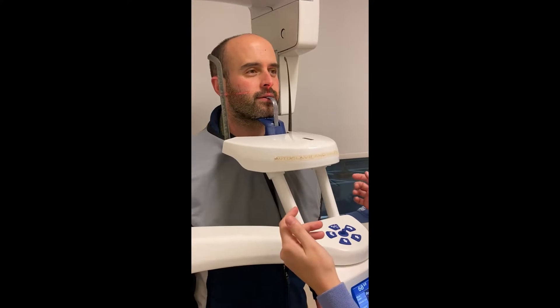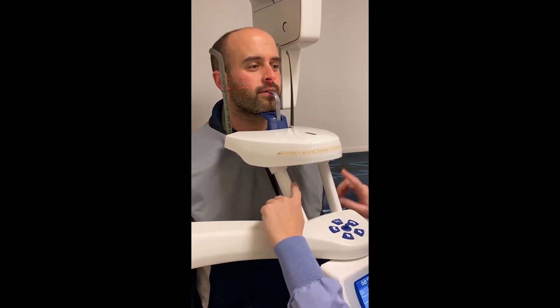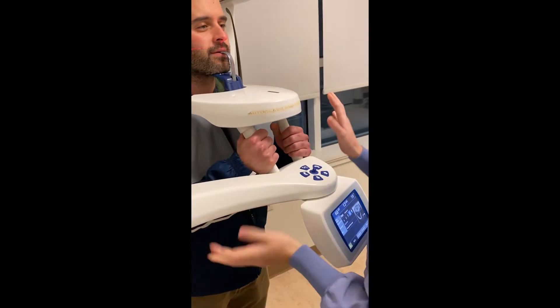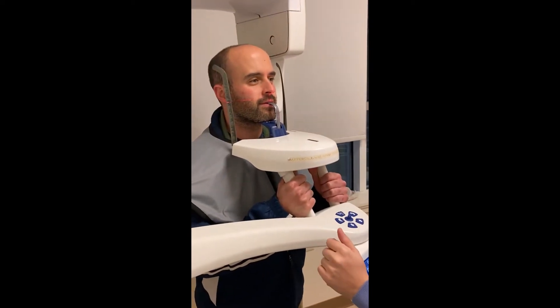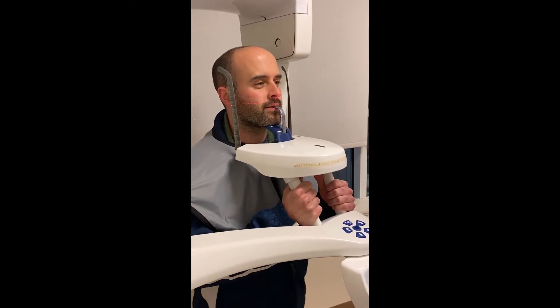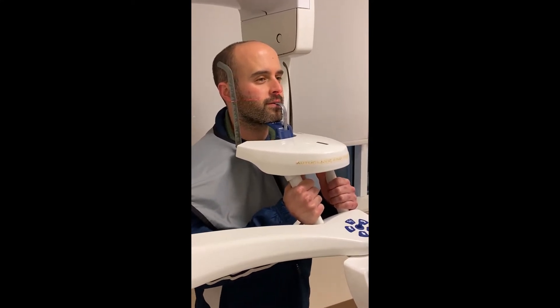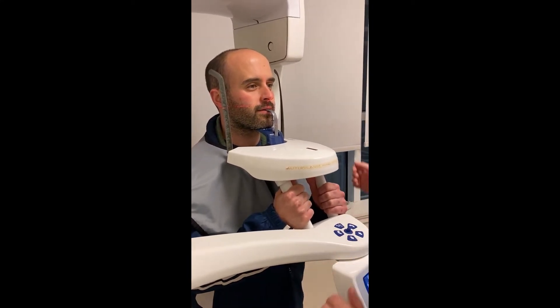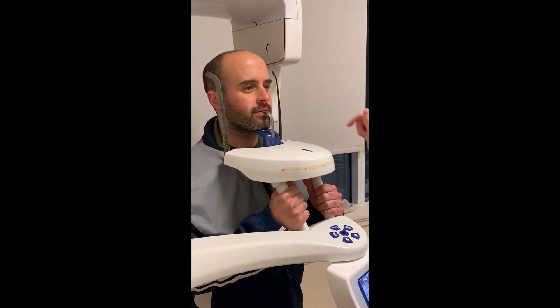Ask the patient to hold the hand rest, guiding their hands over and having them clench. Next, have the patient put their feet together. When they put their feet together, this sometimes adds a little height, so make sure to check that the chin is still parallel with the floor.